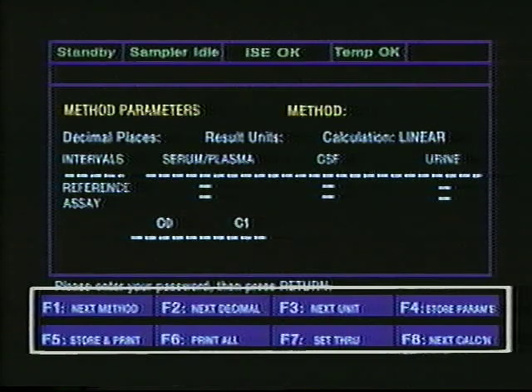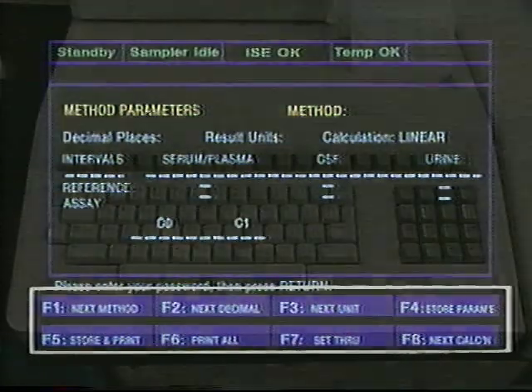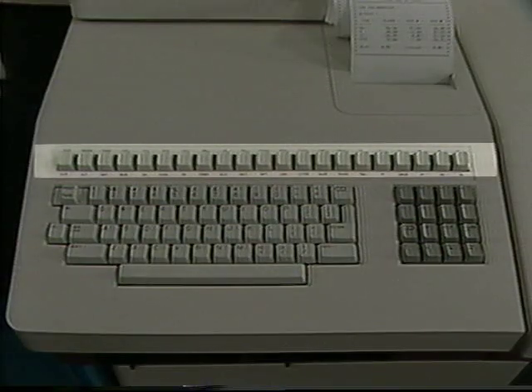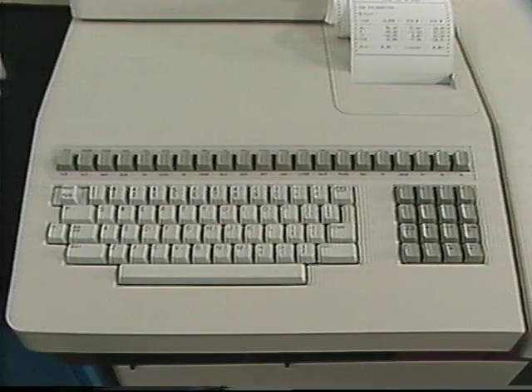The bottom two lines of the screen display are the soft functions area. These functions are redefined as each new screen display appears.